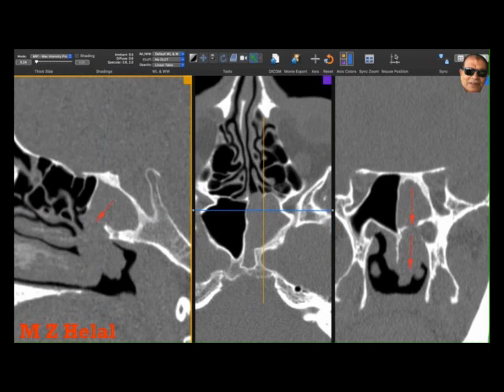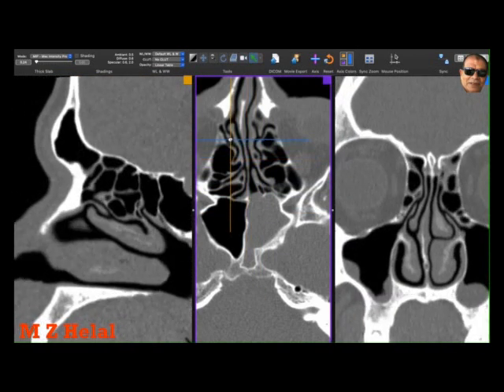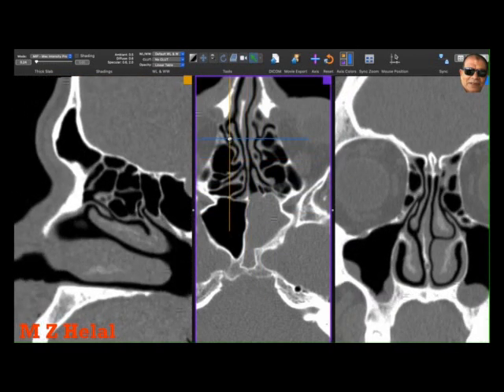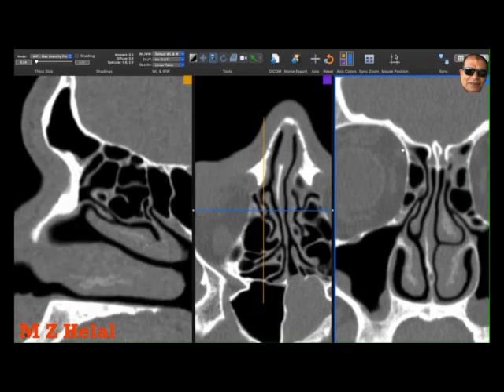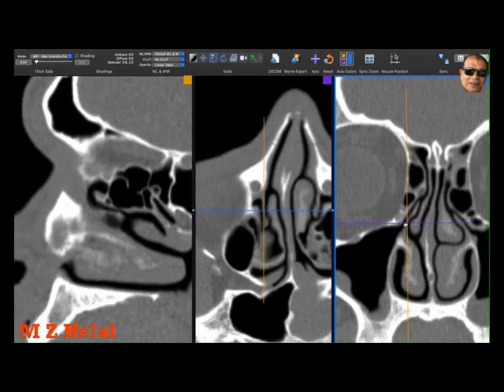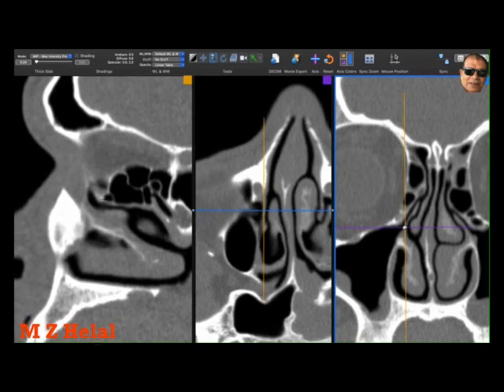Here is the polyp going to the choana. This patient has something interesting related to his uncinate process attachment. Here is the right uncinate process, and we know that uncinate process attachment is crucial for the determination of the pattern of drainage of the frontal sinus. Here is the root of the right uncinate process.